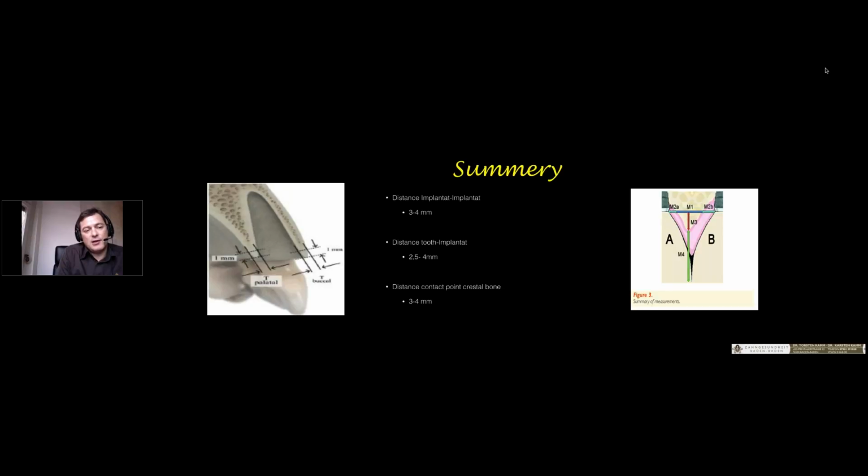If you have a contact point like a normal tooth, 6 up to 8 millimeters above the bone, then you will lose your soft tissue in this area, and you're getting no papillae. This is the reason, as in the first slide from my pictures, we have no fibers going inside the root. If you have a normal tooth, you have fibers going inside the root that can stabilize the papilla. If you have a normal implant, we have no fibers. This is the reason that our contact point has to go 2 up to 3 millimeters down to the soft tissue, like in normal cases.